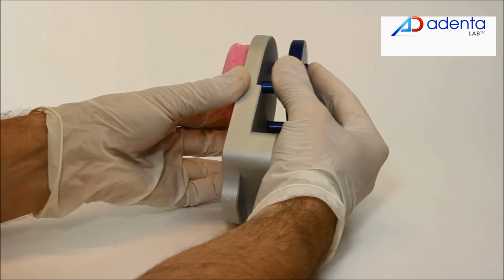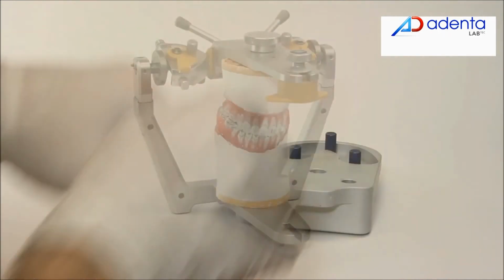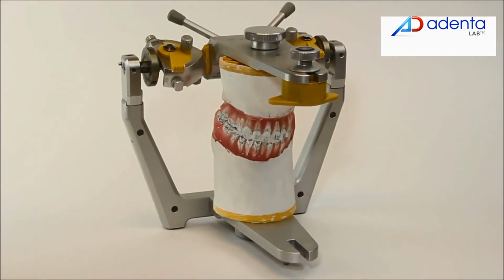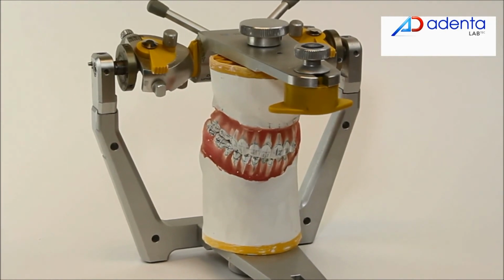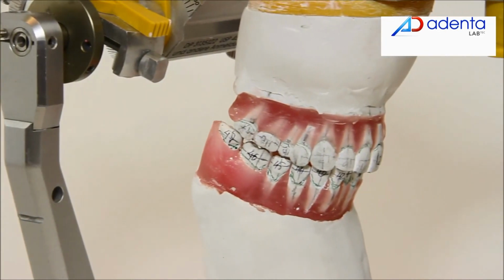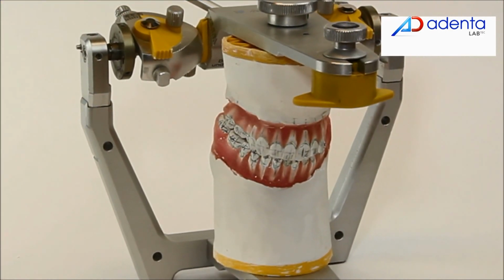Use the occlusal impression ejector to remove the silicone from the tray. Follow the same procedure with the lower model. In this way, the setup model is finished and ready for correction.